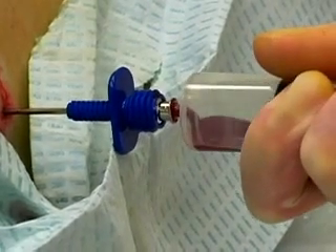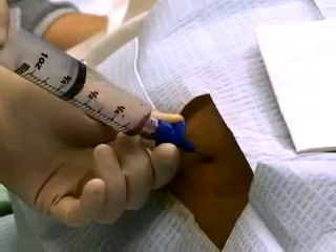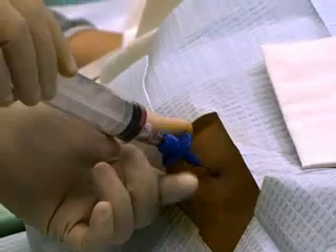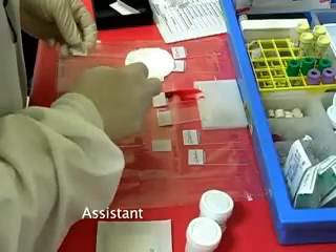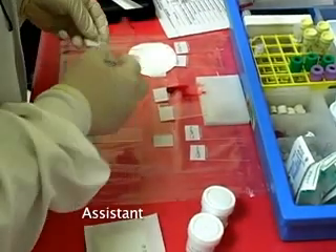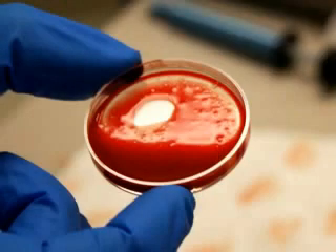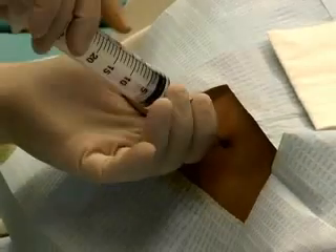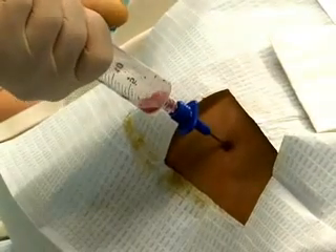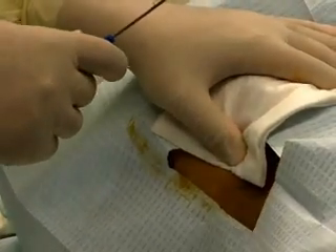Since the aspiration itself can be particularly painful, it is prudent to warn the conscious patient before you aspirate. Note that you may hand a syringe to an assistant or pathologist, taking care to maintain sterility. The non-heparinized aspirate should be used to prepare specimen slides. Adequacy of the specimen can be verified by the presence of bony spicules in the sample. Next, aspirate marrow into syringes containing 1 milliliter heparin as needed for diagnostic tests. Remove the aspiration needle and apply pressure with sterile gauze until you are ready to perform the biopsy.